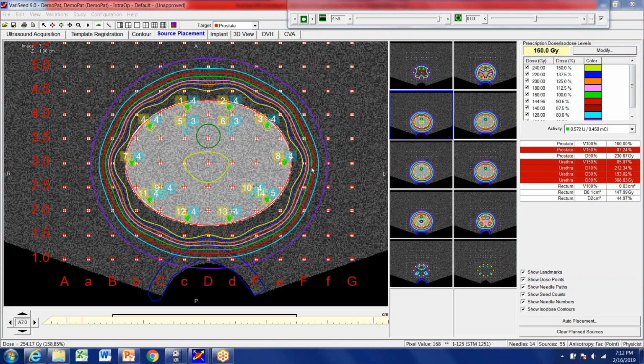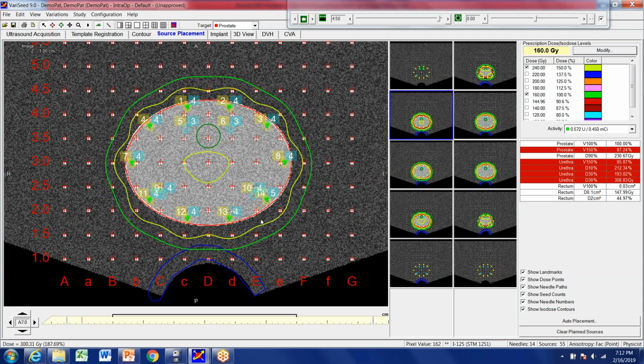So we have to optimize so that we comply with our dosimetric alert. What I usually do is I just take out the isodoses that are not really important, so as to have an overview of what I'm doing. And remember, you are in the operating room, and this has to go so fast. You have to do the planning so fast because everybody is there waiting to start treating the patient. So they are waiting for your plan, so it has to be fast.